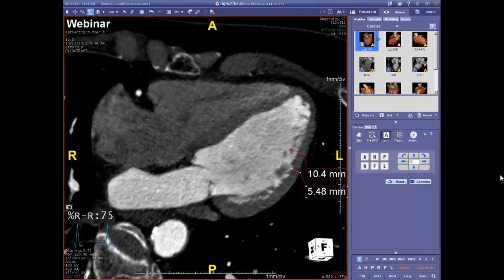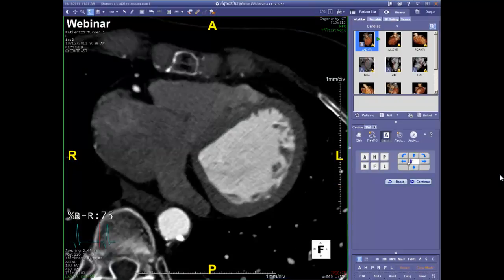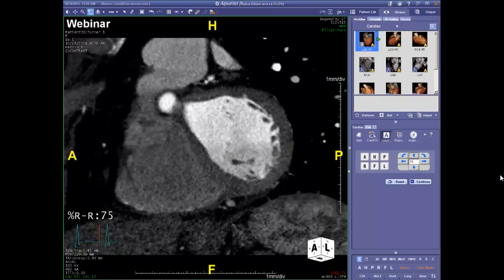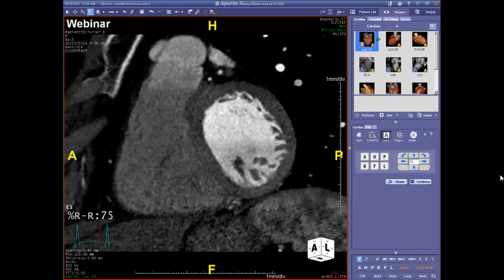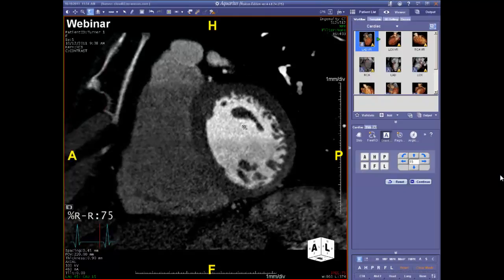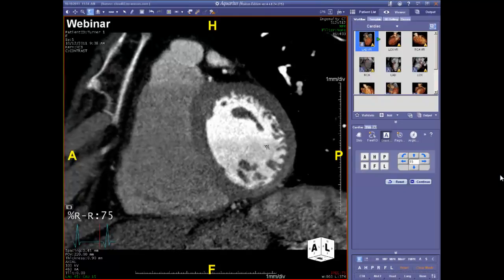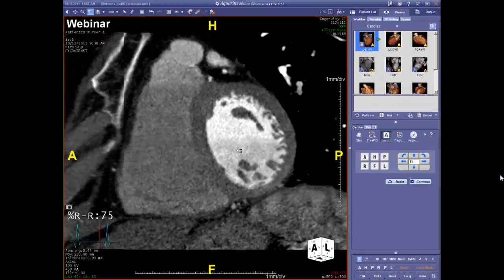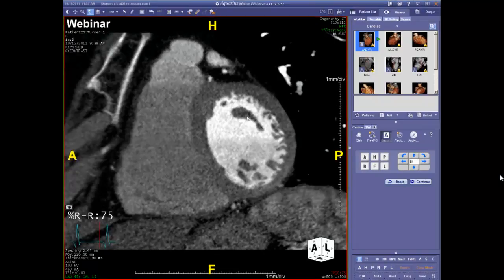We just got asked if we could show the short axis view. Sure, absolutely. Let's set up a short axis view - go to a straight coronal view and then rotate into it. Typically a short axis view I consider a 45-degree LAO with some caudal-cranial angulation of about 15 degrees. I think I might have overdone the brightness and contrast, so let me make things look a little bit better - some tweaking. I'll go over the CTA window. That looks pretty good and I hope it's transmitting well.